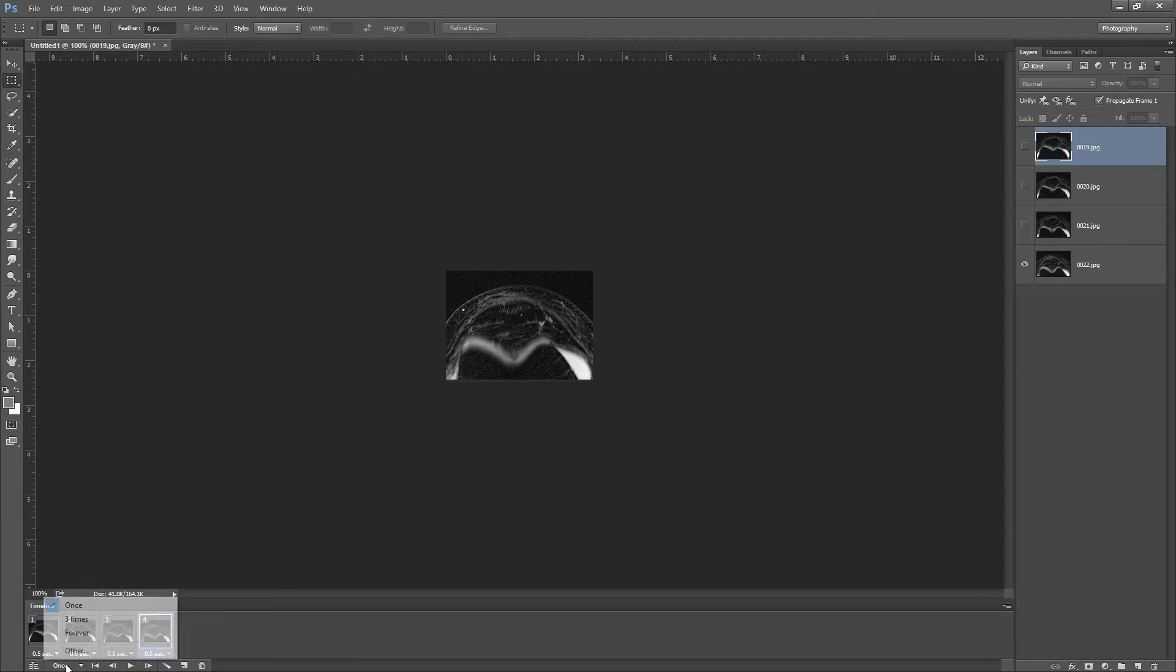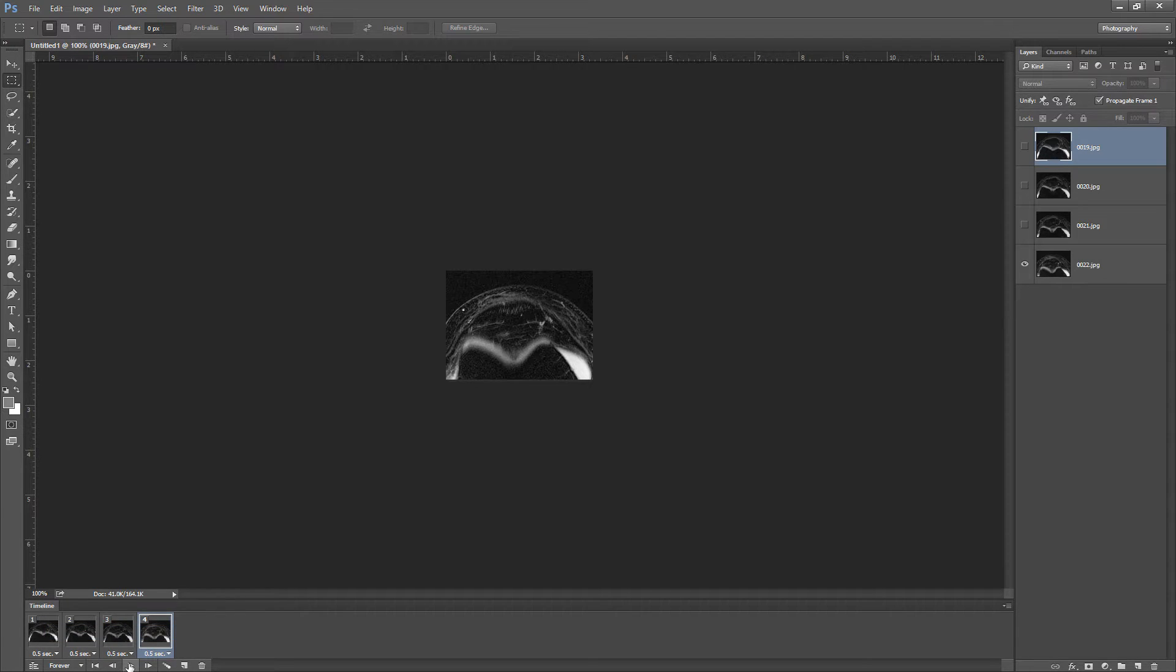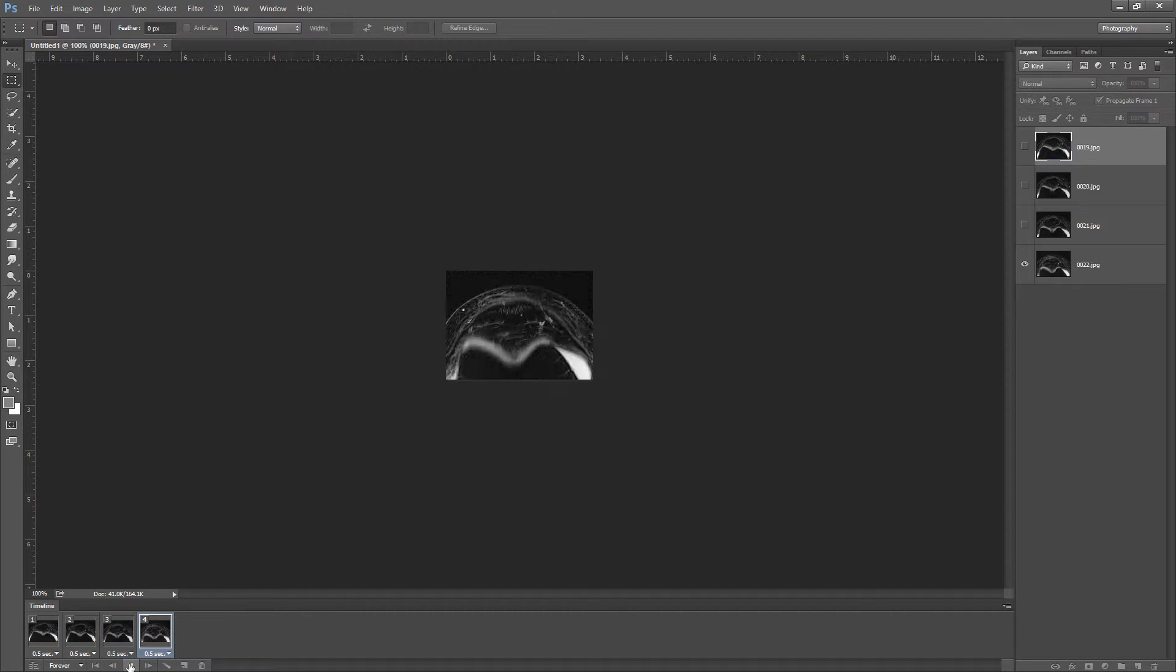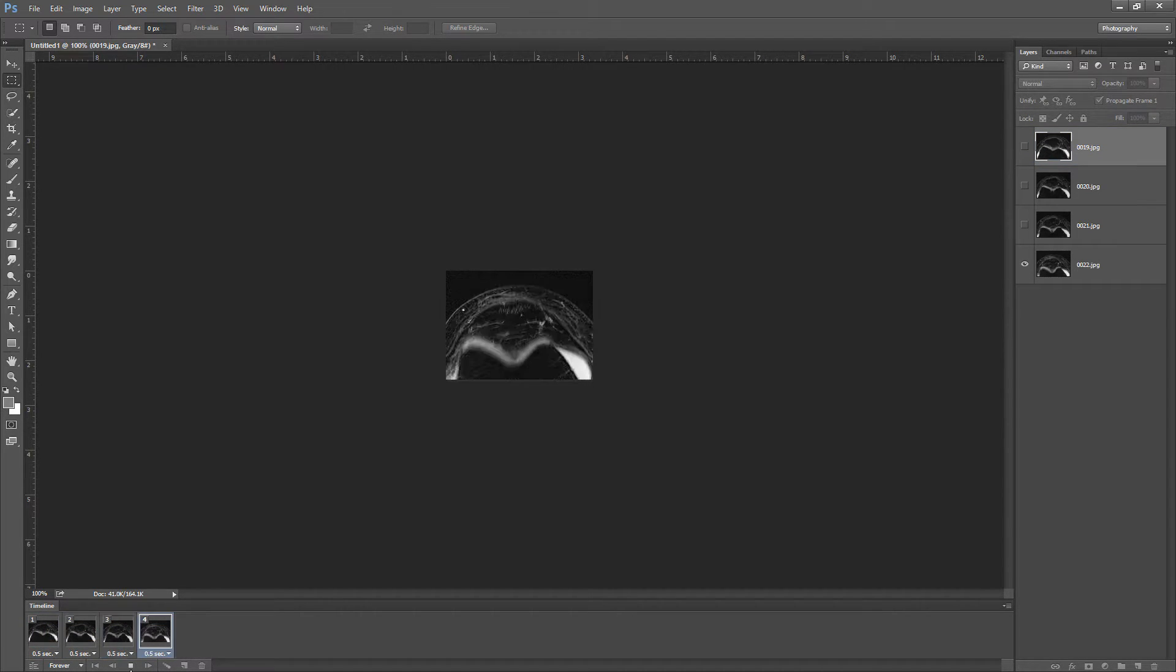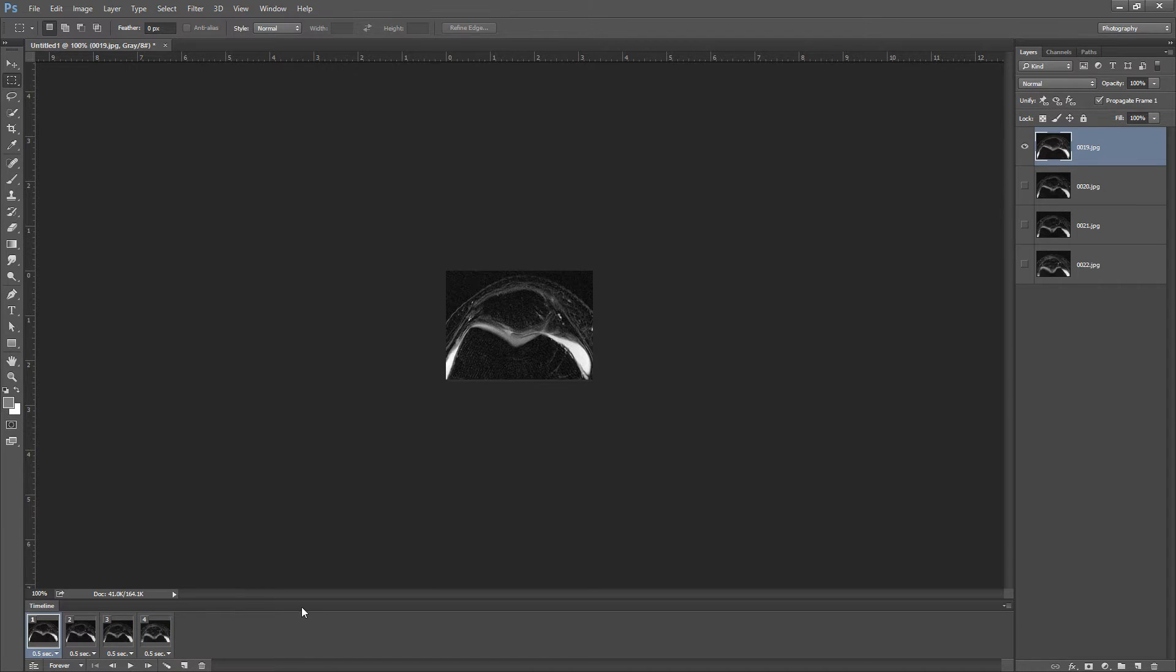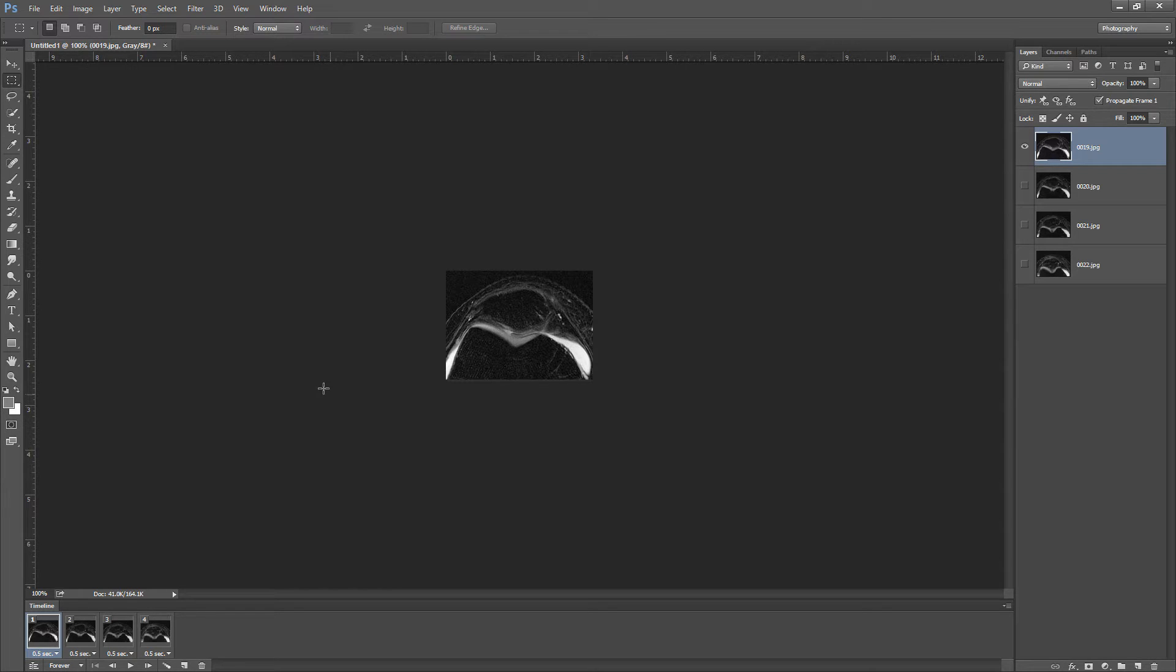Then I want this to loop forever. So I'm just going to play this, make sure it's going how we want. It's looping through those nicely and so that will just play infinitely. And that's what we want. You can add in arrows to track with something on each frame if you want. That's a little bit trickier. You can play with that.